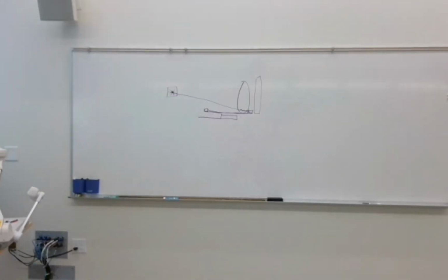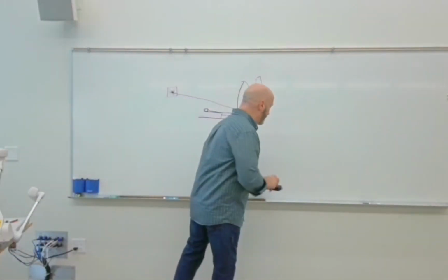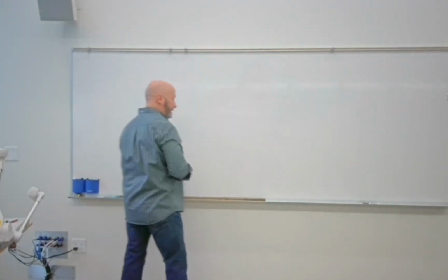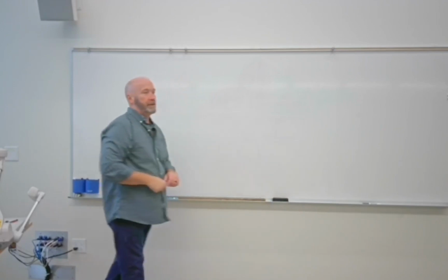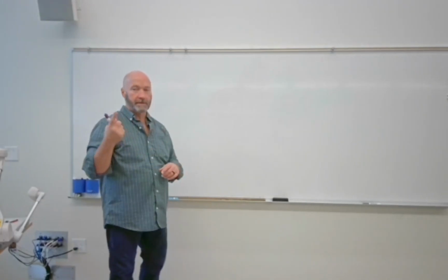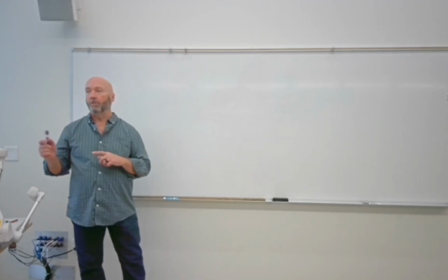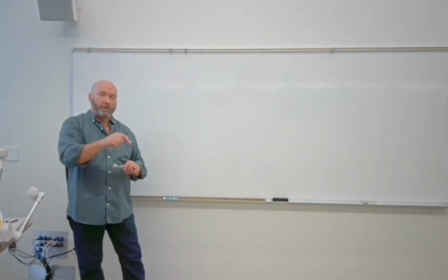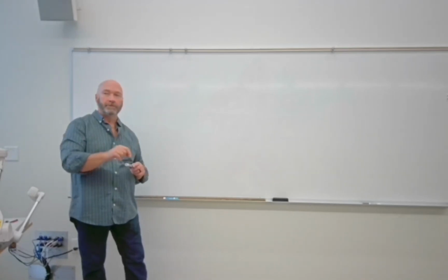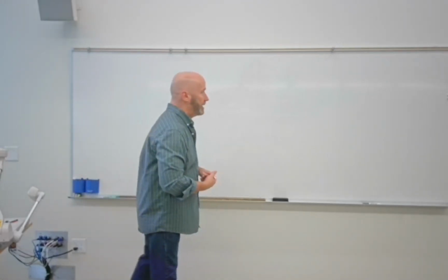So we talked about the operating console and what we control at the operating console. And we're going to spend pretty much the rest of the day talking about the X-ray circuit. Everything in the X-ray circuit that you control directly, with the exception of one thing, is going to operate off a lower voltage, okay? You don't want to be pushing buttons that have power to them of 150,000 volts, right? So they're going to be lower voltage.